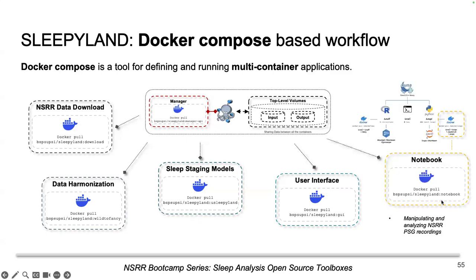And then we are also exposing this other important container. To me, it's really important because this is the way you can interact with all the other containers via the notebook, via Jupyter Lab notebook, so coding in Python basically. And here we also decided to include all the stuff that Luna developed via the Luna API, which was exposed maybe last year, more or less, from the NSRR.